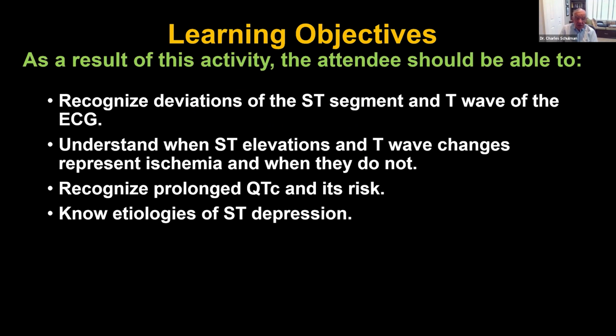The learning objectives are to recognize deviations of the ST segment and the T wave, to understand when ST segment and T wave changes represent ischemia and when they do not, to recognize prolonged QTc and its risk, and to know etiologies of ST depression.